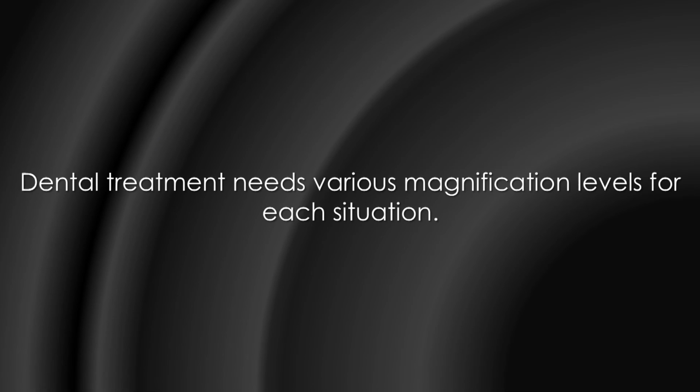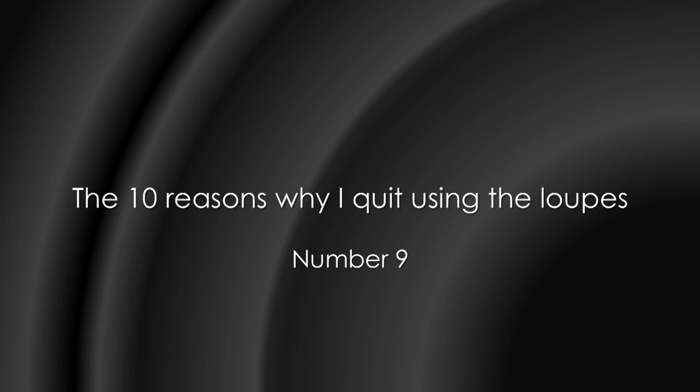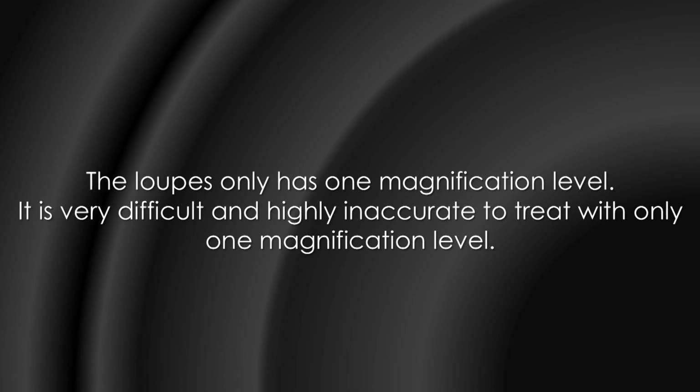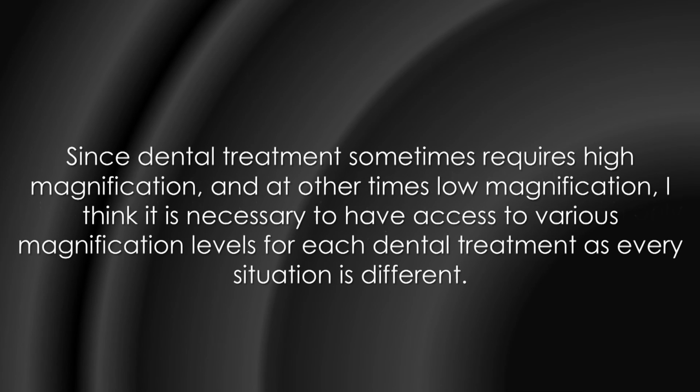Dental treatment needs various magnification levels for each situation. Number 9. The quality of treatments when using the surgical microscope is far superior to that of the loupes. The loupes only have one magnification level. It is very difficult and highly inaccurate to treat with only one magnification level. Since dental treatment sometimes requires high magnification and at other times low magnification, I think it is necessary to have access to various magnification levels for each dental treatment as every situation is different.